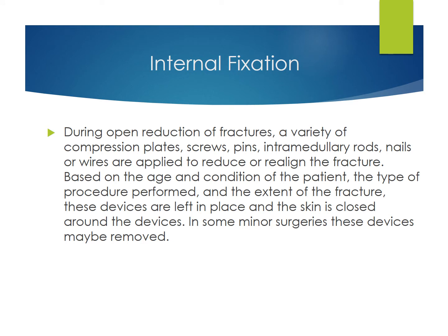Internal fixation. During open reduction of fractures, a variety of compression plates, screws, pins, intramedullary rods, nails, or wires are applied to reduce or realign the fracture. Based on the age and condition of the patient, the type of procedure performed, and the extent of the fracture, these devices are left in place and the skin is closed around them. In some minor surgeries, these devices may be removed.